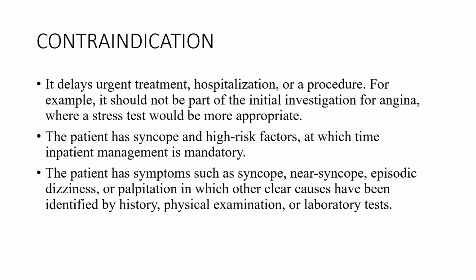Or patients that have symptoms of syncope or near syncope that have been diagnosed through history, physical examination, and laboratory tests, and are responding to treatment from those investigations. There will be no need for a Holter monitor in those patients.